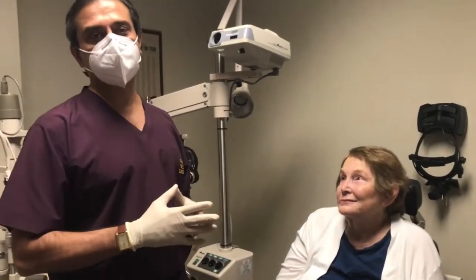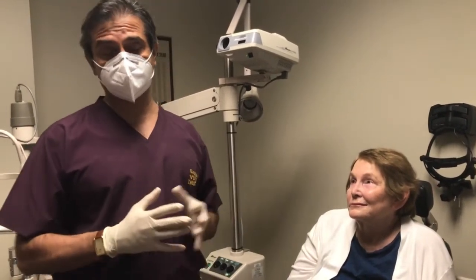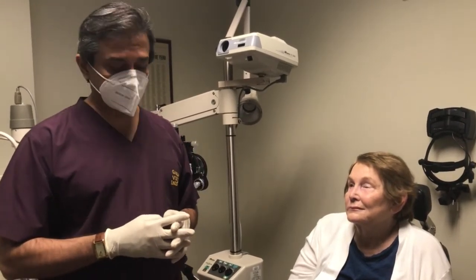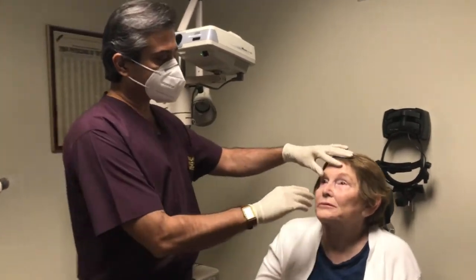This is for the doctors watching — we showed you how we inserted the Prokera in this patient with a neuropathic ulcer who also has very tight lids because of blepharoplasty. And even then, they tolerate the Prokera very well. Were you comfortable through the weekend? Oh yeah — lovely. And today's Monday. She never even knew it was in there.